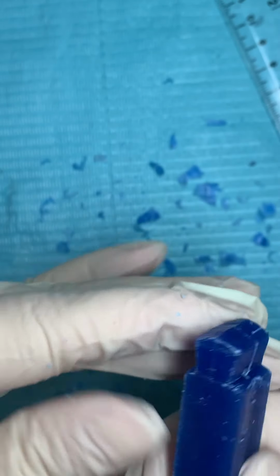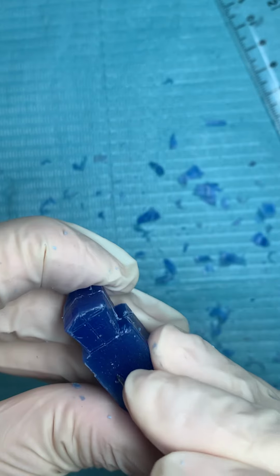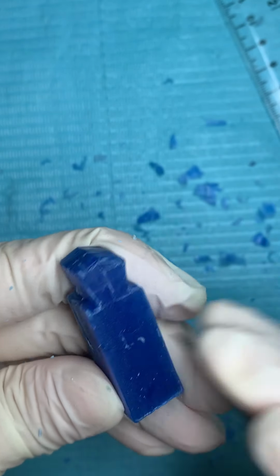I will return back my midline on this surface, the proximal side here. Till now I'm doing the same steps. I didn't do any change from the previous tooth. Okay, after that, come here. This will be my buccal side, okay, and this will be my lingual side.